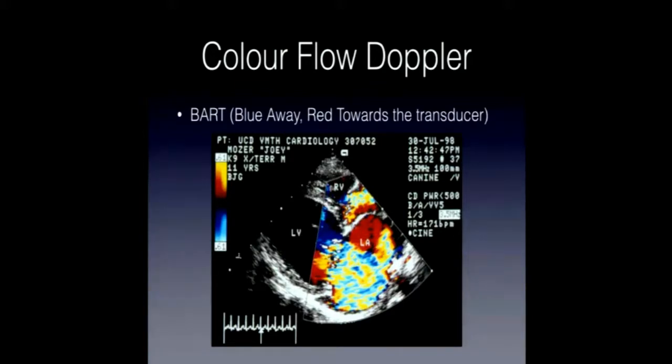Here we have a light blue and a light yellow, and you can see that they exist together within this net of turbulence here, and that's aliasing. You couldn't really have a yellow and a blue right next to each other. Of course, you could have turbulent flow, and then maybe that would happen, but a lot of that is from aliasing. In fact, this software shows white if it's from one way to the next. So that's aliasing for color flow Doppler.